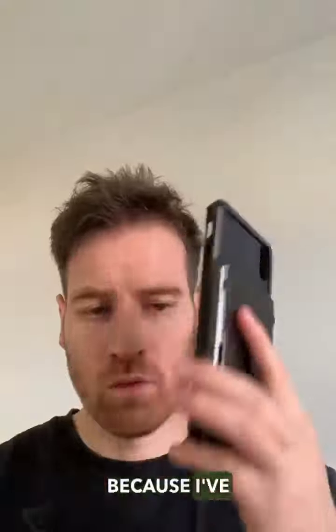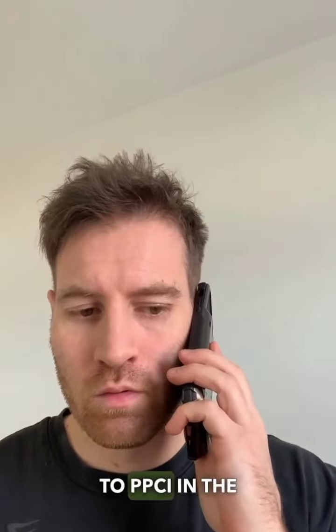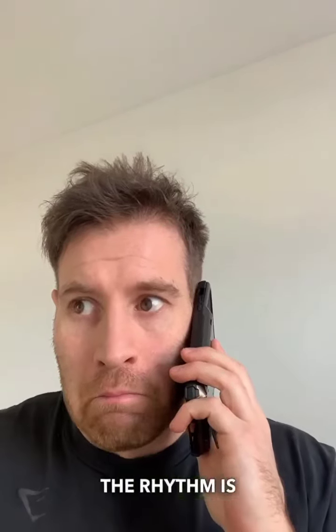Now the elephant in the room is taken care of, I want to make sure I know the underlying rhythm, because I've been caught out on the phone to PPCI in the past when they've asked me what the rhythm is and I didn't know the answer.